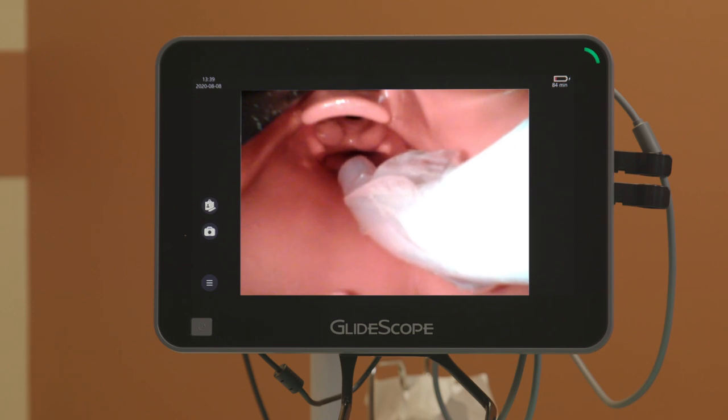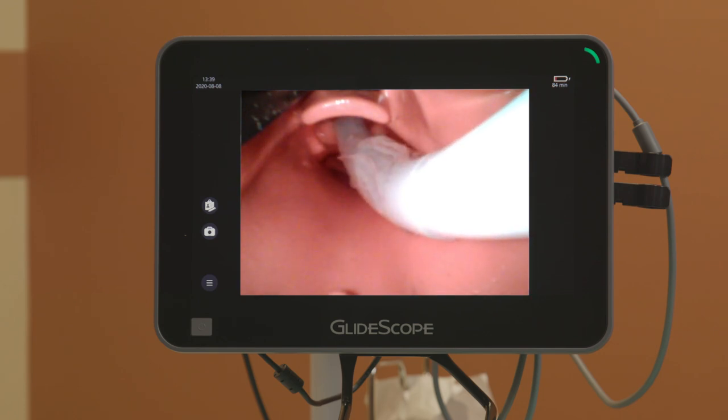I make a point of staying outside of the line of sight of the video device in terms of the tracheal cuff. I want the tube to go low, come up over the notch, without blocking my line of sight to the target.